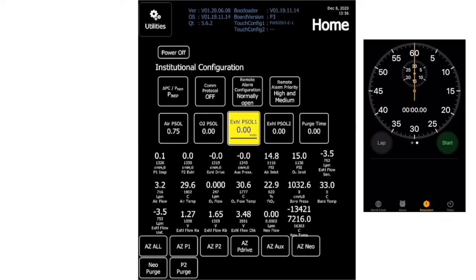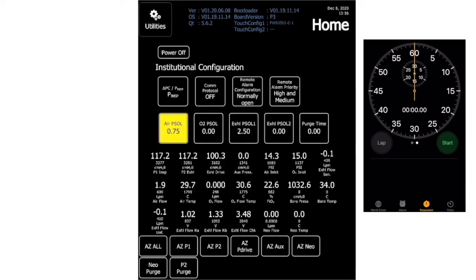Now, since I'm checking both sides, inspiratory and expiratory, I'm turning my exhalation PSOL number 1 all the way up, so 2.5 volts. And let's go ahead and see what kind of pressure this creates. My pressure is building up, and both my P1 and P2 values are over 100, and they're holding. So now I'm going to turn off my airflow, and let's see if it holds over 10 seconds.